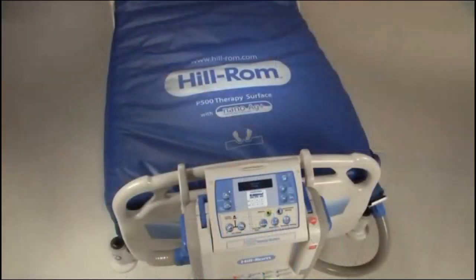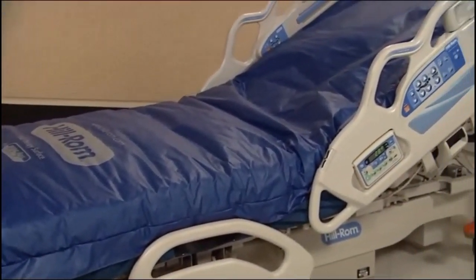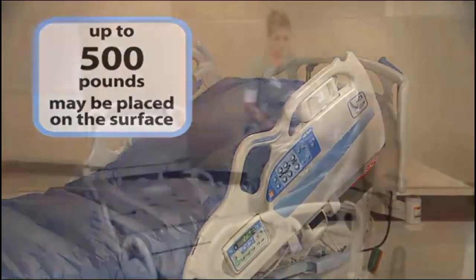This presentation will cover the features of the P500 Therapy Surface. In addition, we will demonstrate the air control box, along with several key aspects to enhance the operation of the P500 Therapy Surface to better meet the needs of your patient. The surface is a weight-based pressure redistribution surface with a therapeutic weight limit of up to 500 pounds.